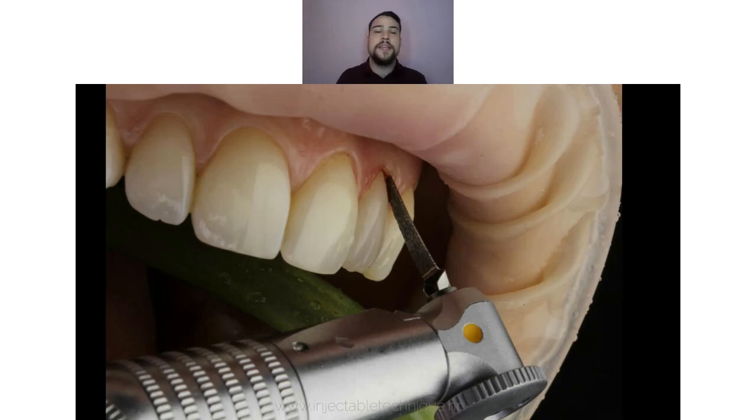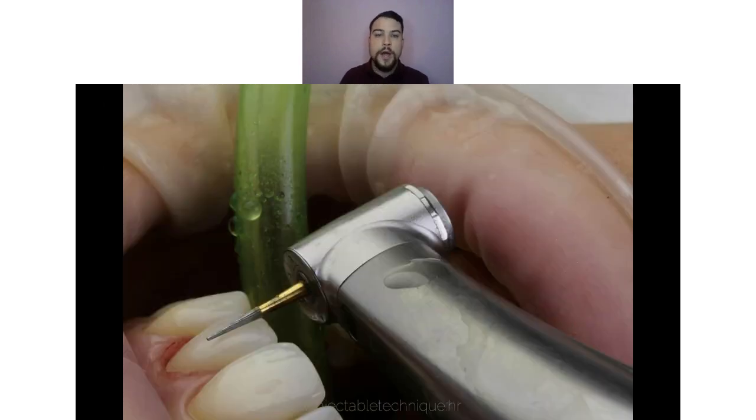You can also use this EVA handpiece, which has cones inside that make those two-dimensional movements to polish margins to the gingiva. Because it doesn't have a cutting edge, you cannot harm the gums, but you can nicely polish it. If you don't have it in your office, it's not a problem, but it is useful if you have one.